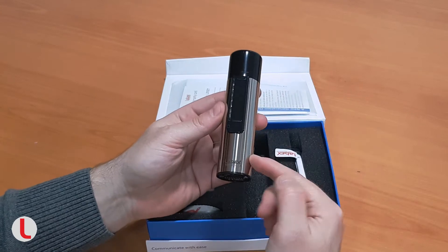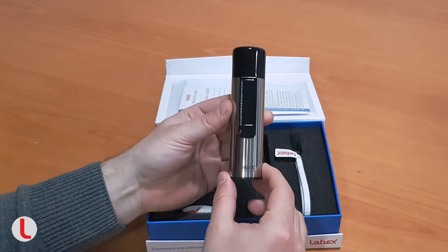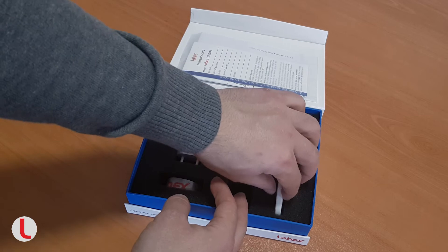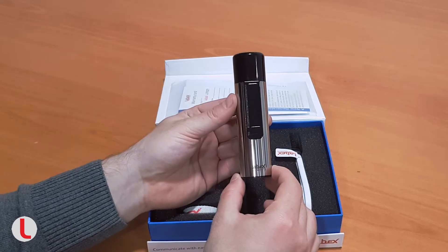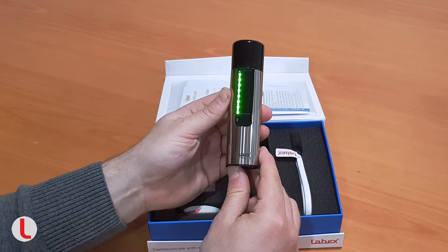You have more than 30 hours of speech time per charge at your disposal. With a single charge you can use the device for more than a week. The charge can be made from any USB port, smartphone charger, car charger, etc. Another feature is the battery discharge level check that can be made at any moment.